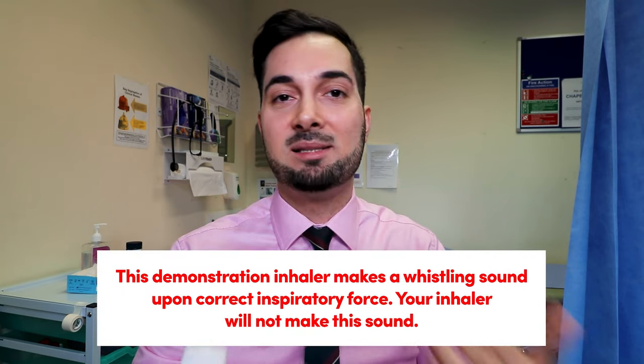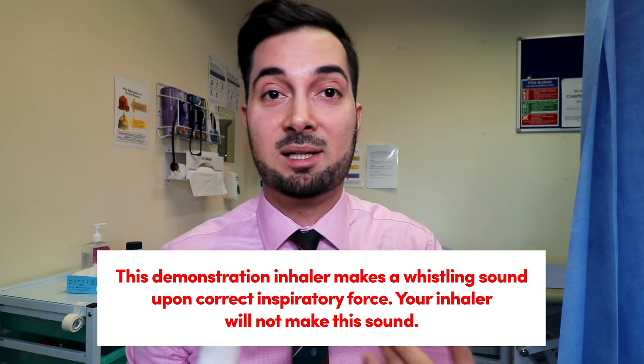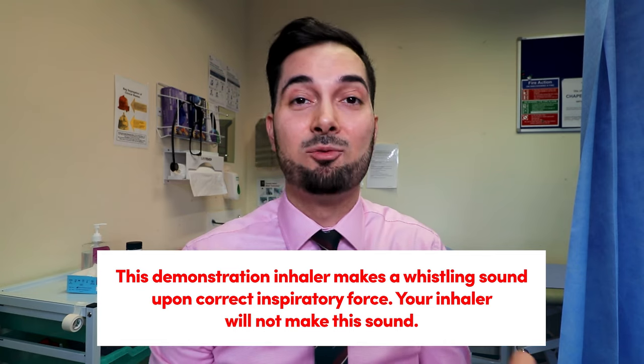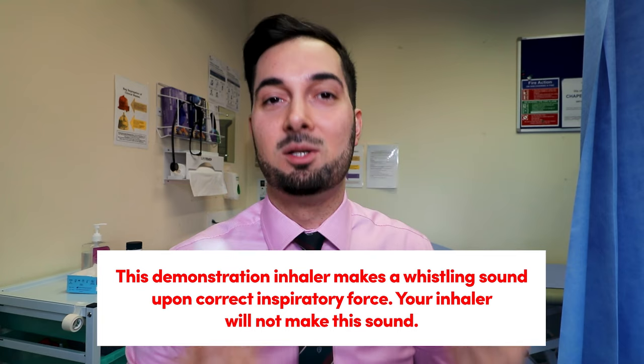Make sure you're not covering the bottom air inlet. Take a breath out first, then wrap your lips around the mouthpiece and take a deep, fairly forceful breath in — because there's no propellant, your inhalation is what draws the drug in. It requires a quite fast-paced deep breath. Take in the breath for as long as you can, then remove the mouthpiece, hold your breath for about 10 seconds or as long as you can, and then gently breathe out looking the other way.